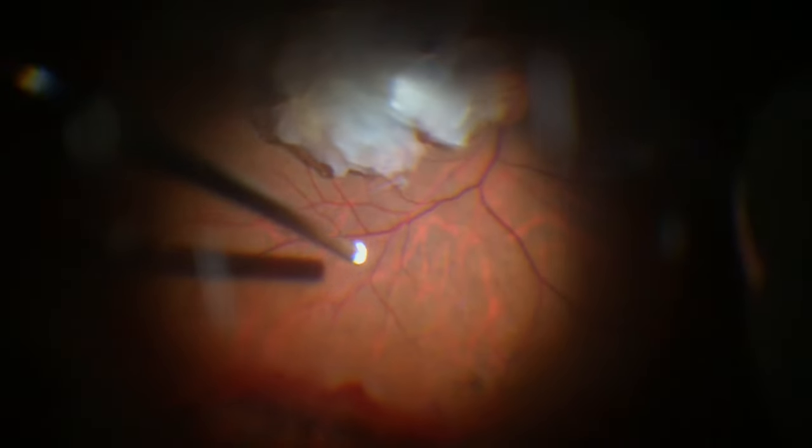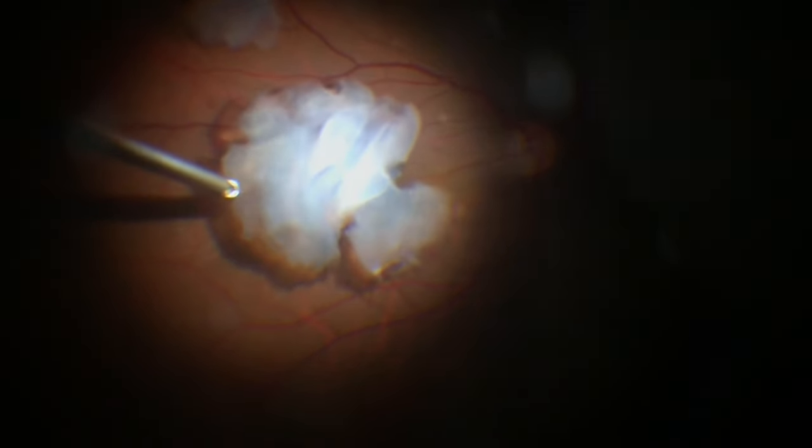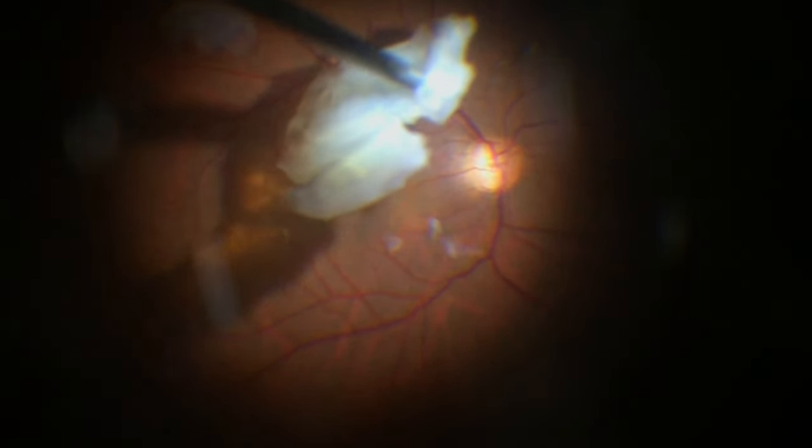Consuming this lens takes more time compared to phacoemulsification because the cutter port has no ultrasound energy — only the portion aspirated into the cutting port is consumed. The nucleus or cortical matter must be soft enough to be aspirated, and the fragmented pieces are now being consumed this way.